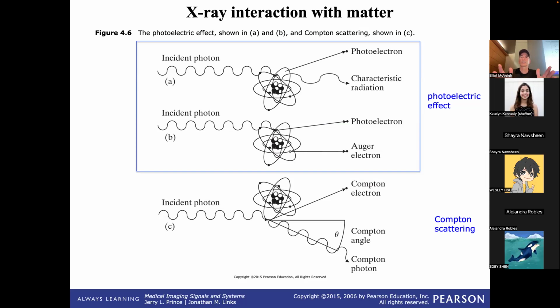This can be a confusing part because now we're going to do X-ray interaction with matter. The drawings look very similar to what we just did, but there's a distinct line here. What we just looked at was electrons hitting a target to produce X-rays. That's a collision experiment. Those are electrons from my cathode hitting my anode, making X-rays.